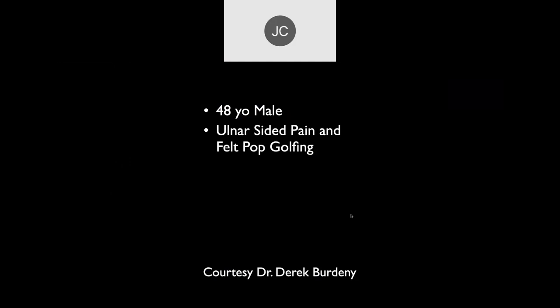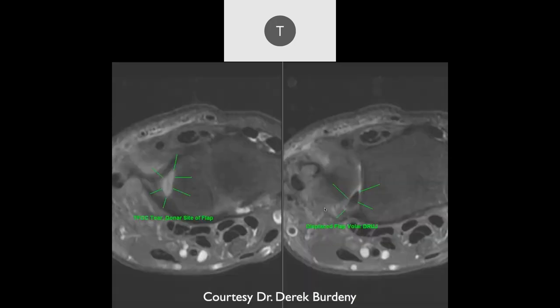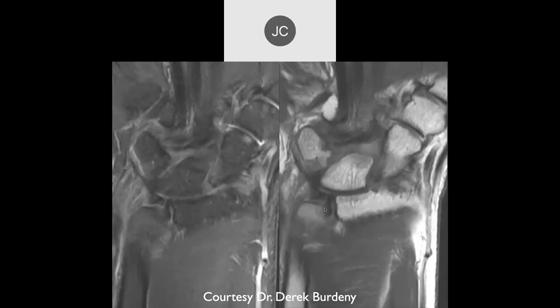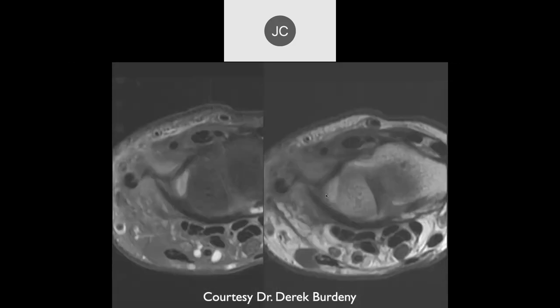Taysen: 48-year-old male, ulnar-sided pain and felt a pop golfing. It looks like there's a flap — like a central perforation as well. We can see it on other images with some displacement of the TFC. Here we can see a much larger defect in the body where that central part of the body has flipped over into that flap.